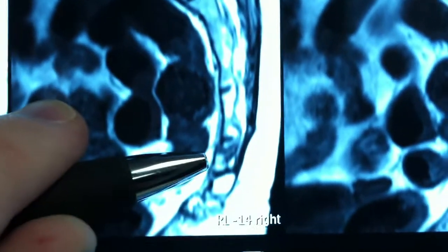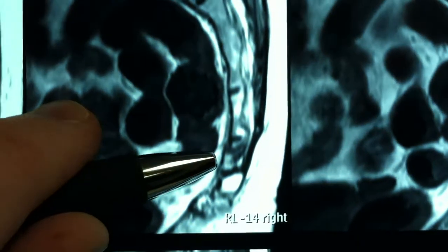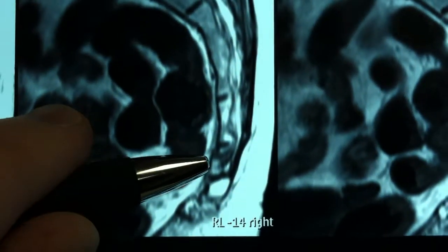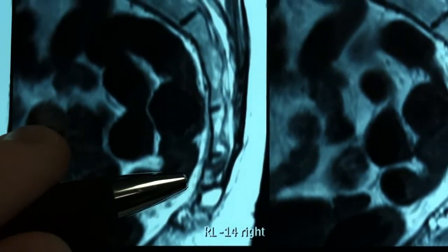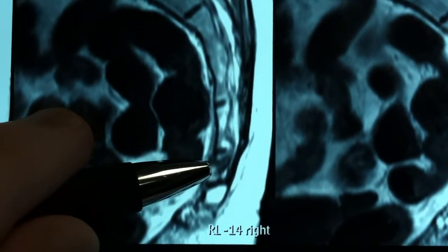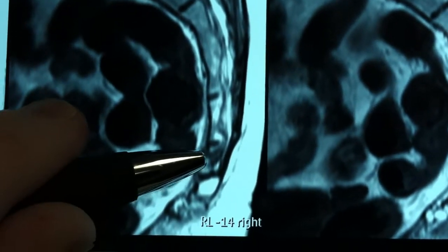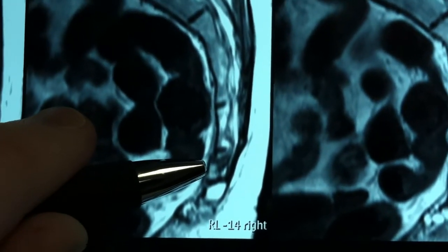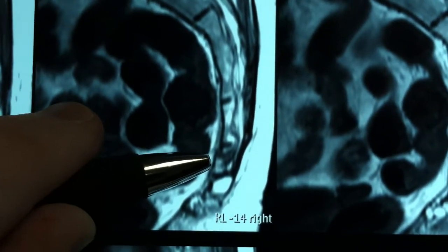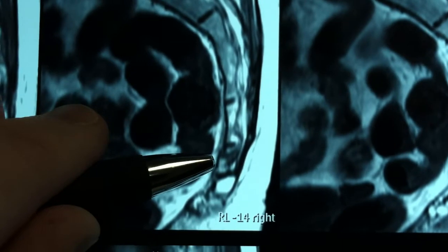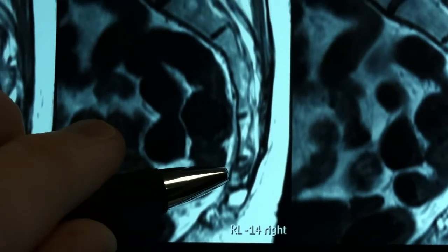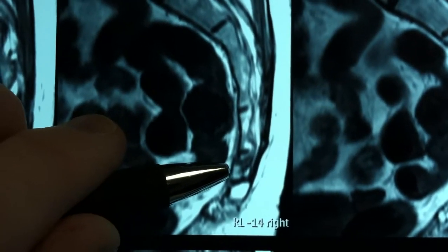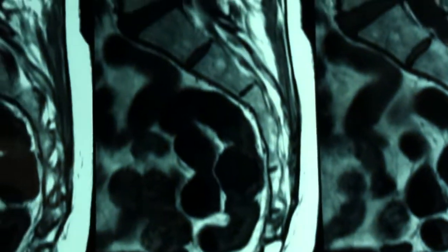Let me focus on that right there. You can see how that bone is disrupted. That's an oblique fracture, basically through the first coccygeal bony segment — so an upper coccyx fracture.